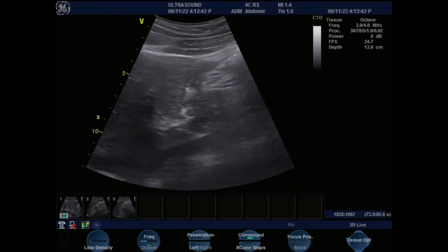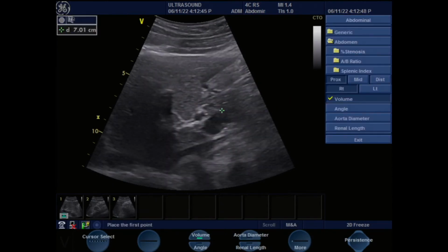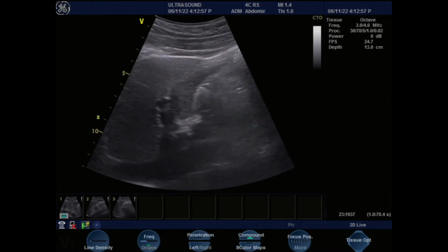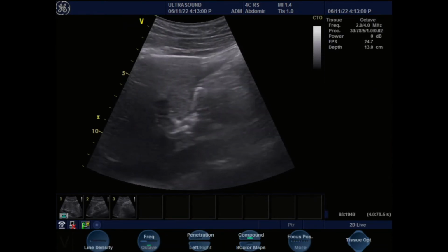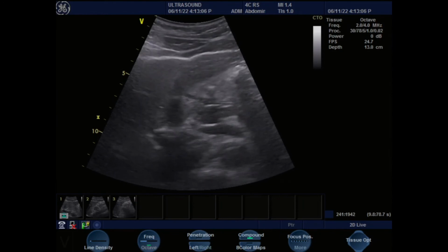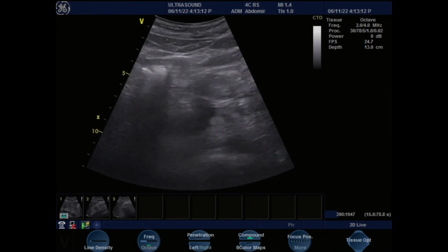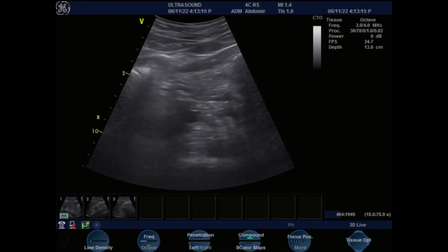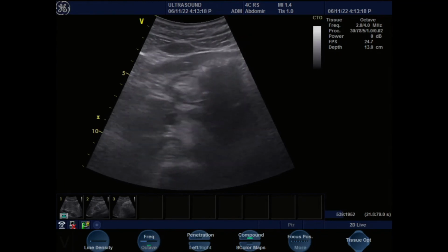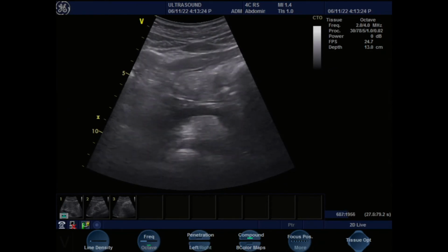I'm going to freeze it and show you the pancreas on that image. So the pancreas is right there. That's the main portal vein, and you're catching a glimpse of the pancreas right there, sagittally. Transverse pancreas is easier to appreciate if you turn your probe transverse and face the notch to the patient's right. Good. Beautiful. We're cutting off the tail. Move over a little bit. Press a little harder. You can see the tail now. Beautiful, right there.